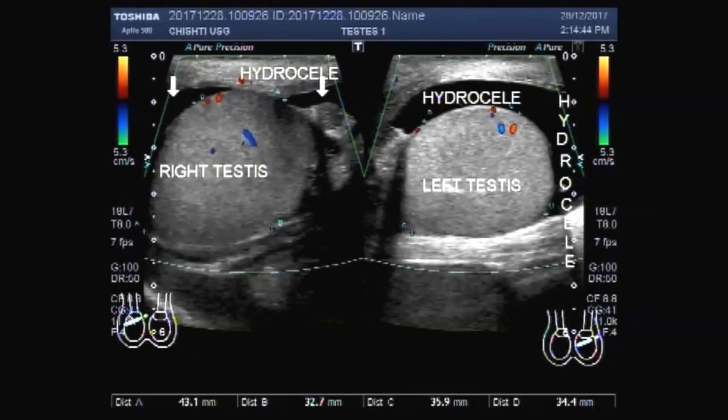Dear viewers, I hope you are all fine. This ultrasound video shows bilateral hydrocele of the testes.